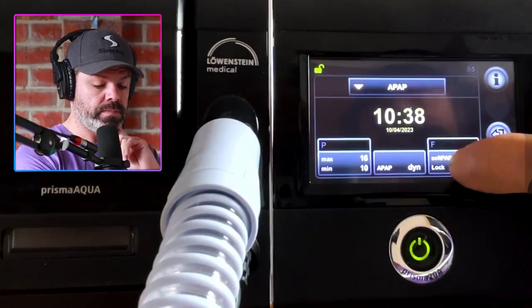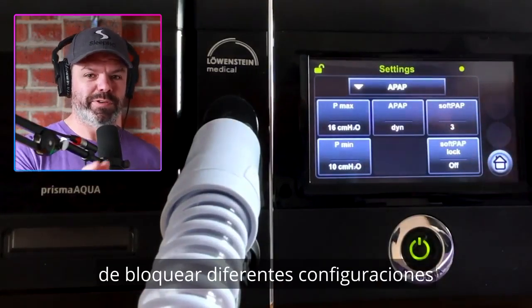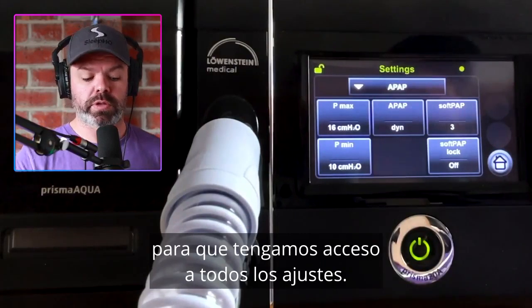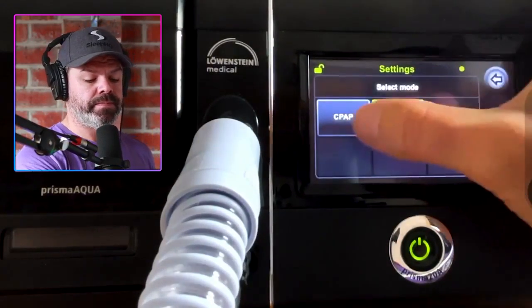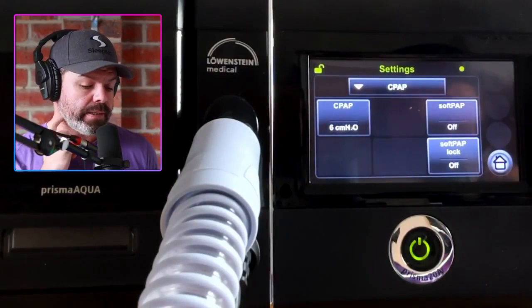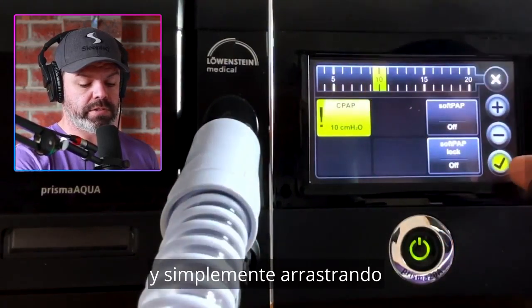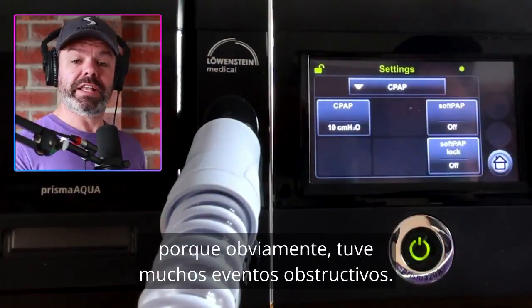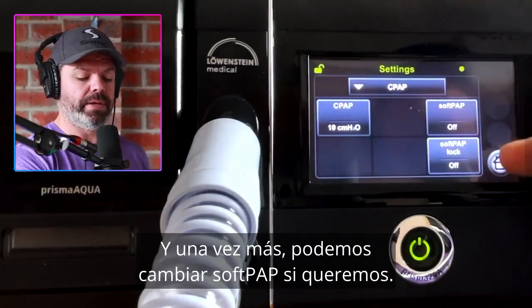The soft pap lock: because we're in the clinician settings, clinicians have the ability to lock different settings. We want to turn all the locks off so we have access to all the settings. Let's go to CPAP mode — we're changing to fixed pressure delivery where the machine will deliver one set pressure. We can change that by clicking and dragging, then clicking the plus. Just changed it from six to 10 centimeters, because I had a lot of obstructive events and my AHI was high, so I needed an increase in pressure. We can change soft pap here too. Going back to APAP mode.